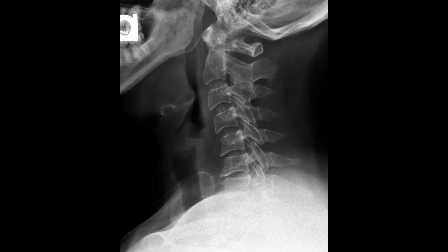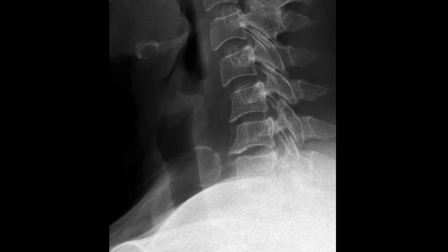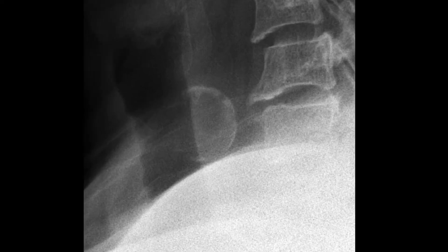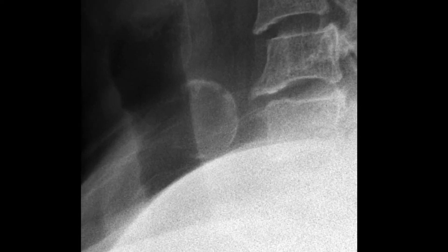On this case you'll note a large calcification inferior to the normal tracheal and laryngeal calcification. Again, this is going to be a thyroid cyst of indeterminate etiology and you'll need advanced imaging for further follow-up. Once zoomed in, this is readily apparent.